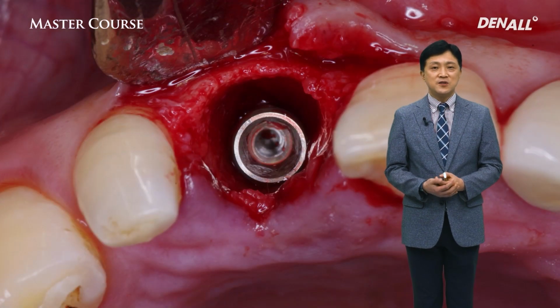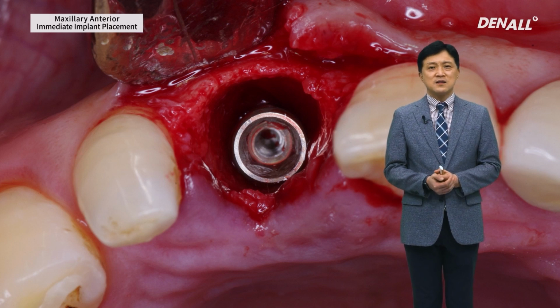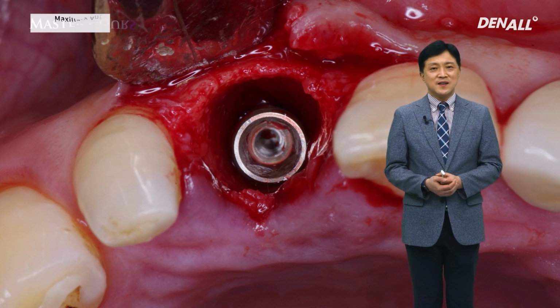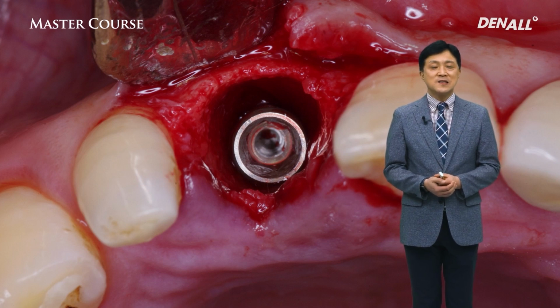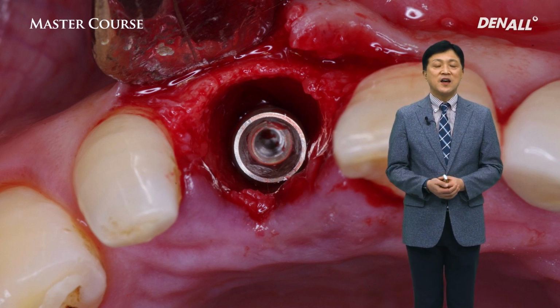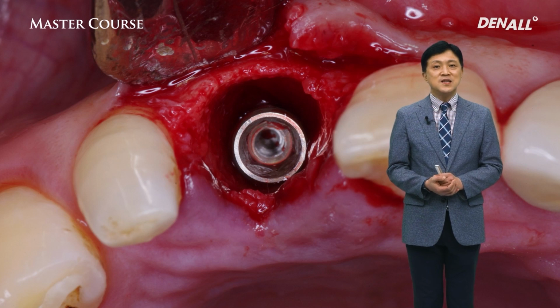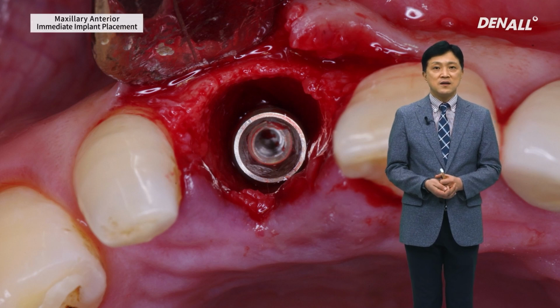Today, we are going to talk about maxillary anterior immediate placement of implant. Placing an implant there, compared to other areas, I believe is very challenging. So many doctors are afraid and get very nervous when they start placing implants in that area. I always get nervous when I place an implant immediately after extraction in the maxillary anterior region.